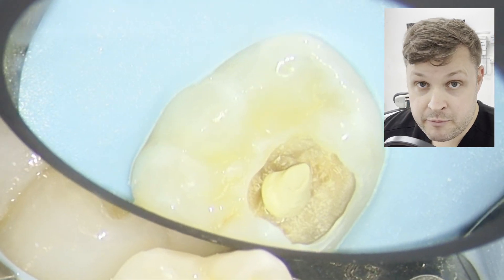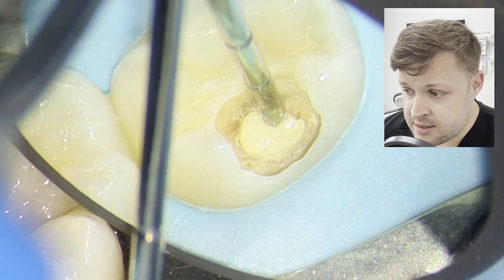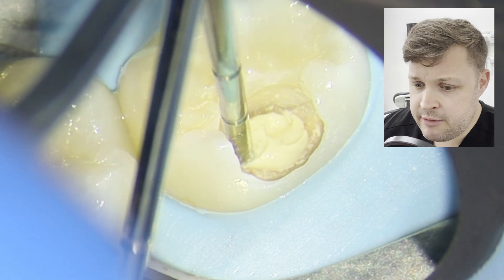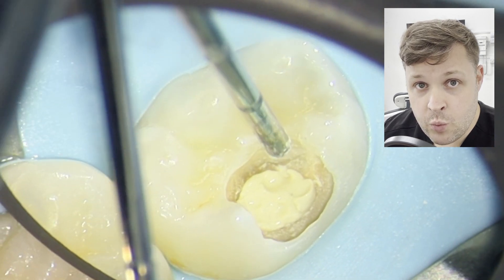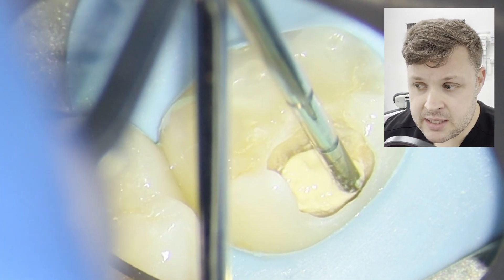I'm now using a bioceramic liner — specifically Biodentin. The thing about Biodentin is it's really nice for the pulp and it also creates a fantastic chemical bond with the dentine itself. It's a great lining material and is less likely to leak than a normal restoration alone.